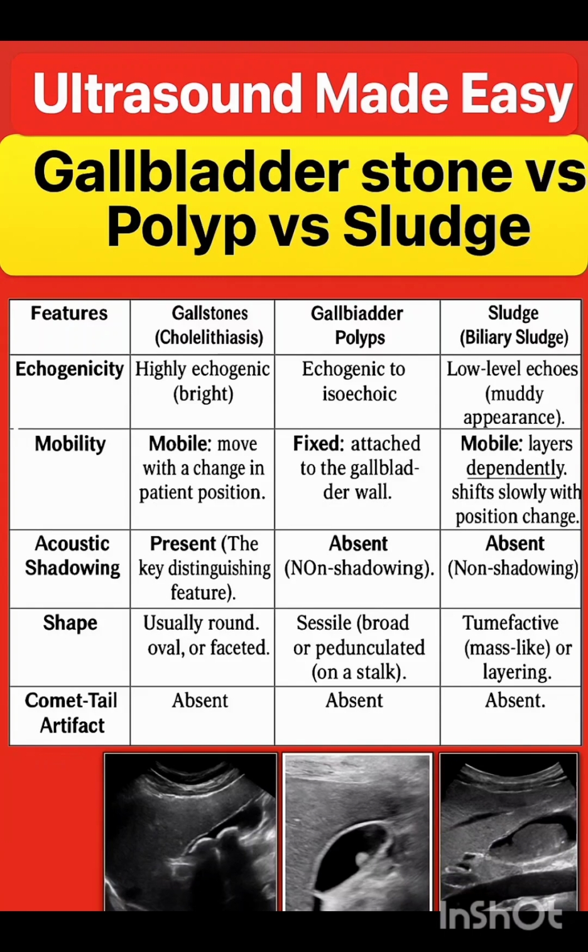So whenever we need to perform gallbladder ultrasound, we need to rule out any gallbladder pathology, always do it in fasting condition. That's all for today.